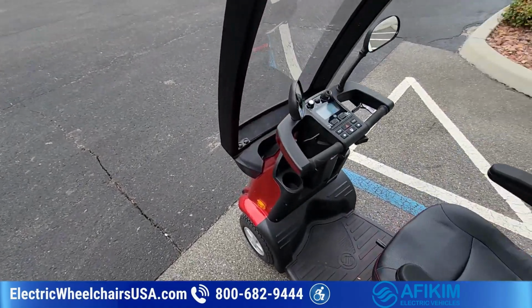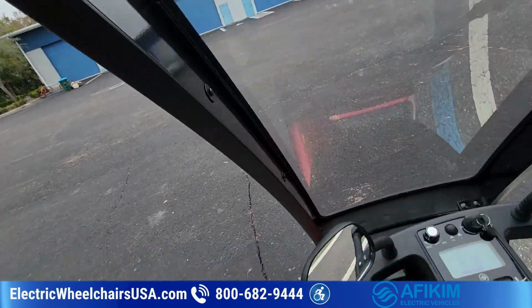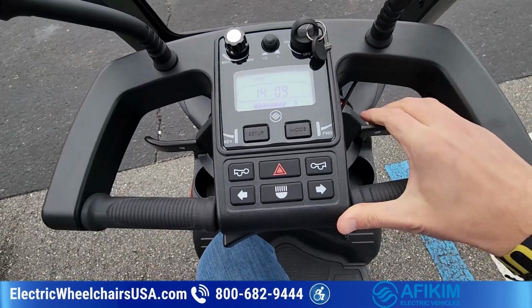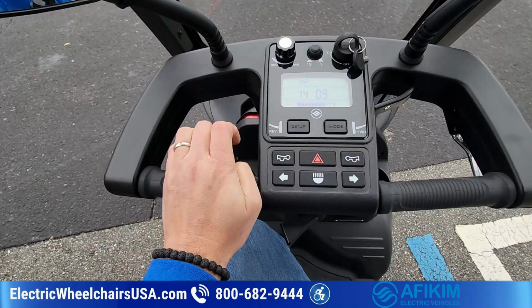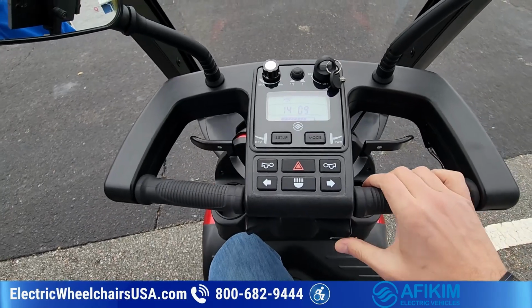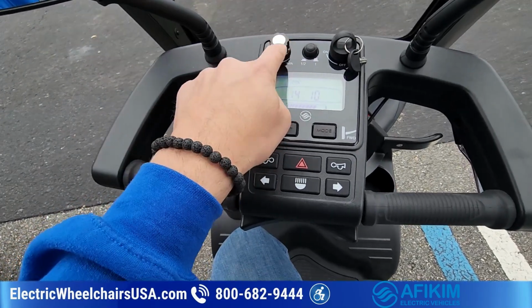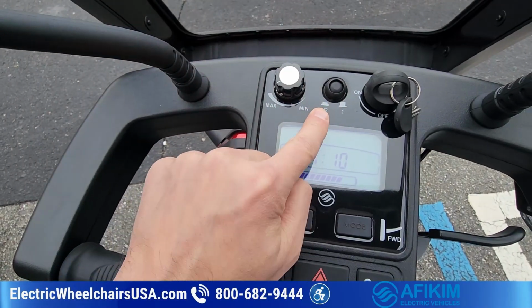Another thing I'll show you real quick here is the controls. They're basically the same, but there are some differences too. So on the C model, you have this ambidextrous throttle where you can accelerate with either hand. You can even accelerate down here if you didn't have good use of these fingers. You can use your thumb to accelerate or go forward or backwards. You also have a set of keys. This is your speed control. This is different than what's on the S model. So if I have this pushed down, you can see it's in this half speed.